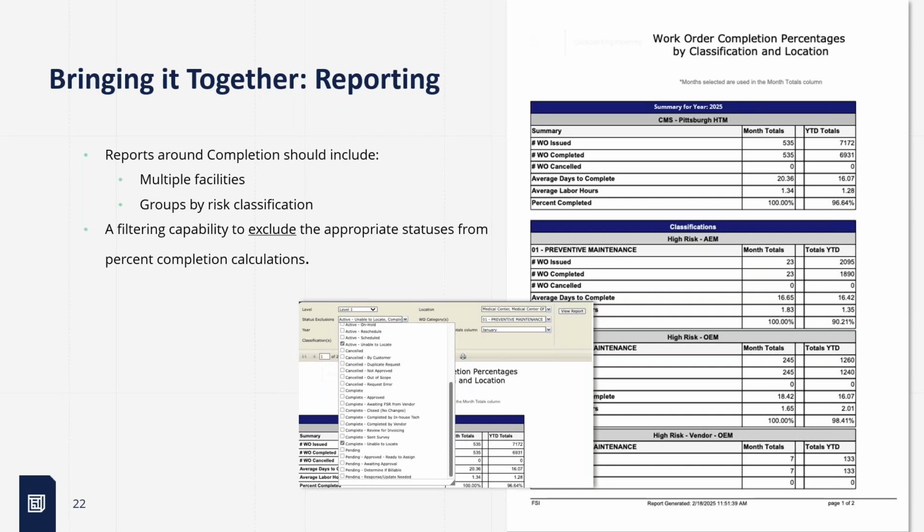So this is an example of, let's say, a percent completion report out of a CMMS, an enterprise asset management tool, might be ours. But you need to have the ability of splitting out those devices and their corresponding PMs or ITMs as unable to locate.